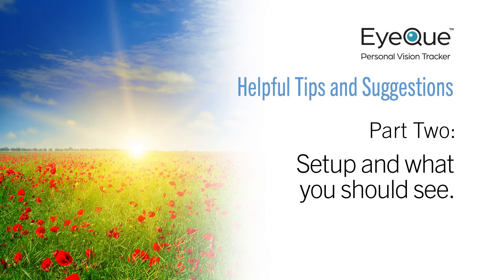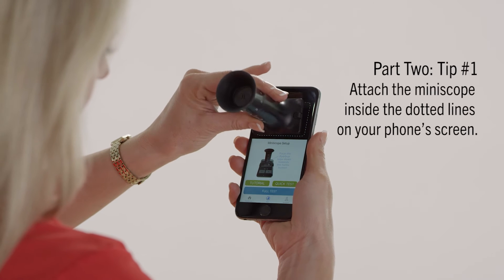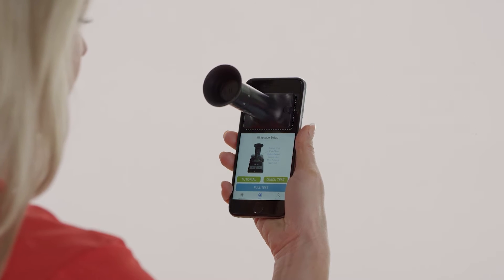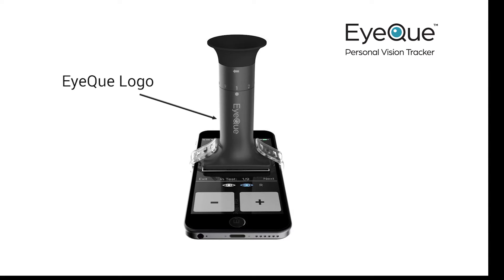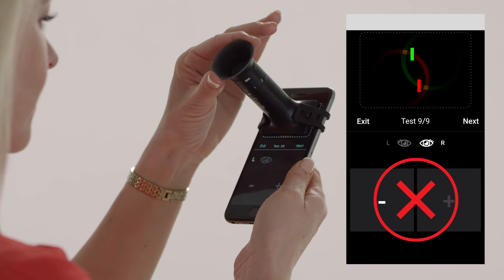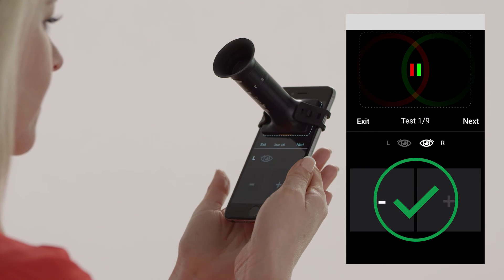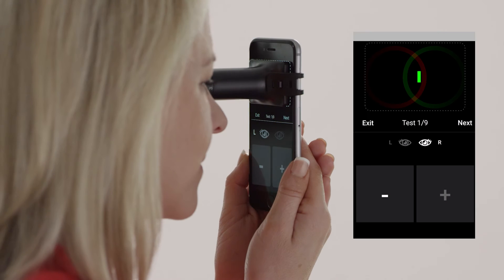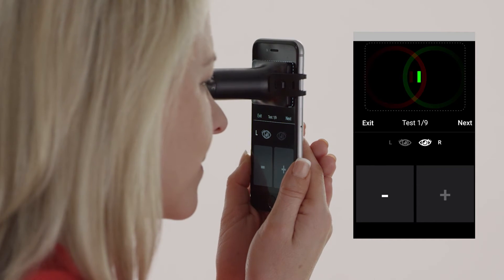Here are some tips about what you should see during your test. Always begin by making sure that the Miniscope is securely attached to your smartphone over the dotted lines. The IQ logo should be facing the bottom of your phone and the rotating eyepiece set to the number one position. On the app screen at the start of your first test, the red and green lines should line up next to each other. If the lines do not appear to be lined up, your rotating eyepiece may not be at the correct number. It's important to make sure that the two lines completely overlap and that you see one solid yellow line.